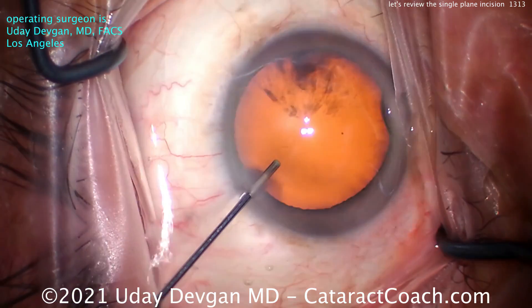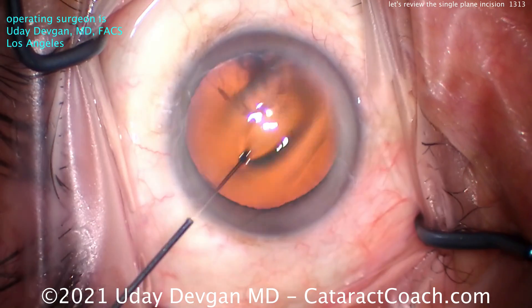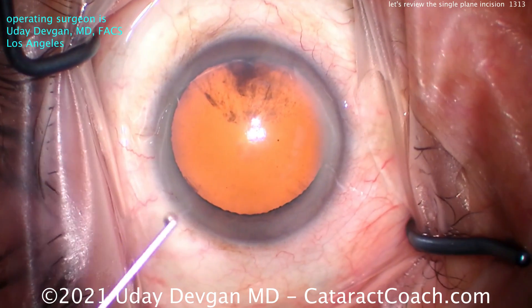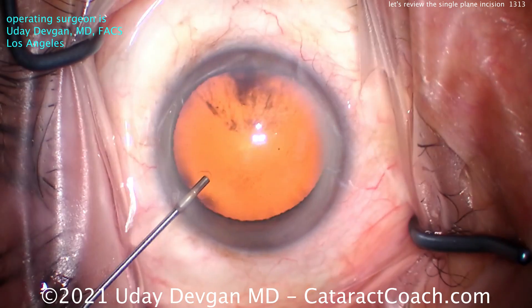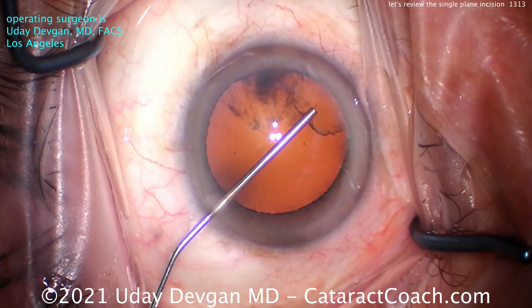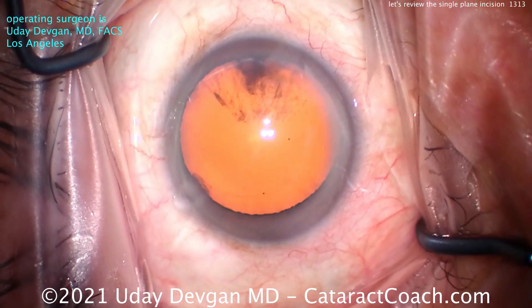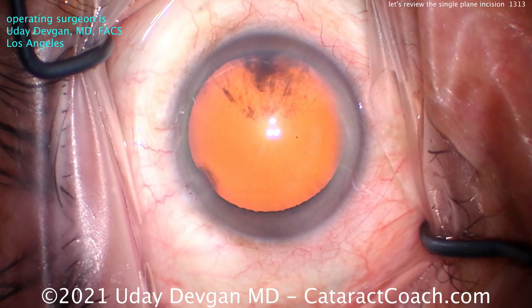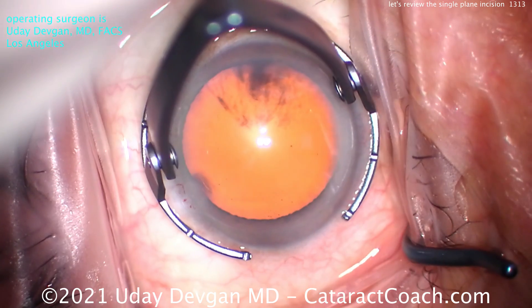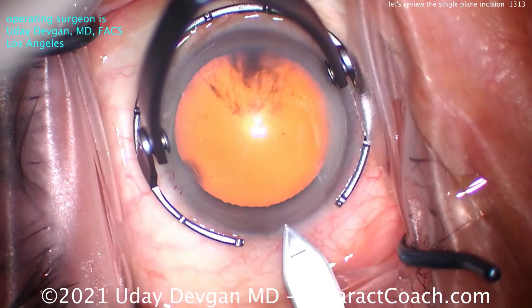If you leave the eye under-inflated with a low IOP, your incision will be too long. If you leave the eye with a very high IOP, the incision will be too short. So the key is to fill the eye with viscoelastic and get a normal IOP — 20 or so millimeters of mercury, plus or minus. Here's the incision.